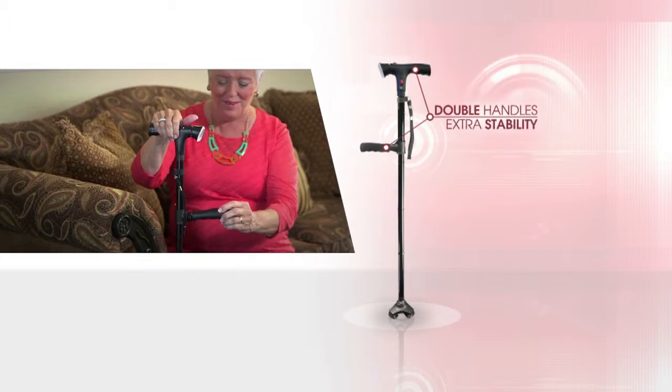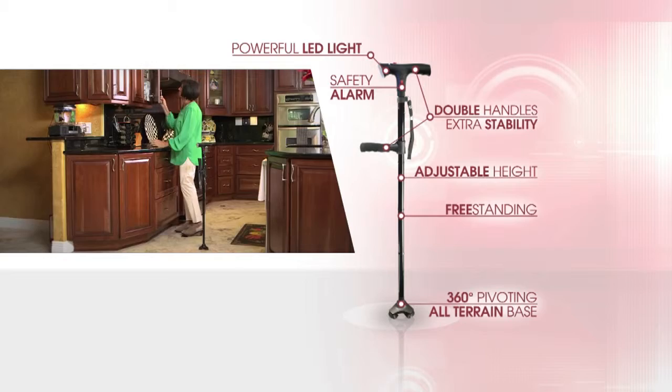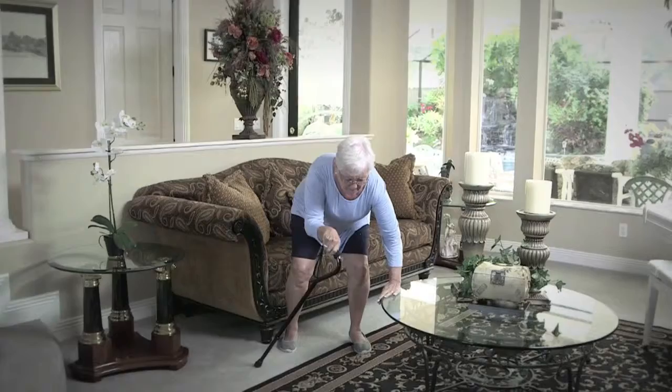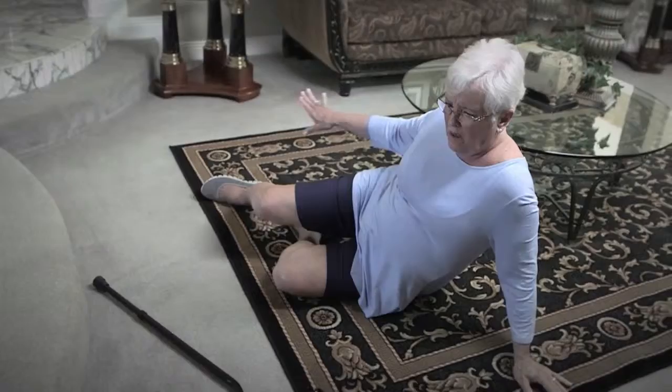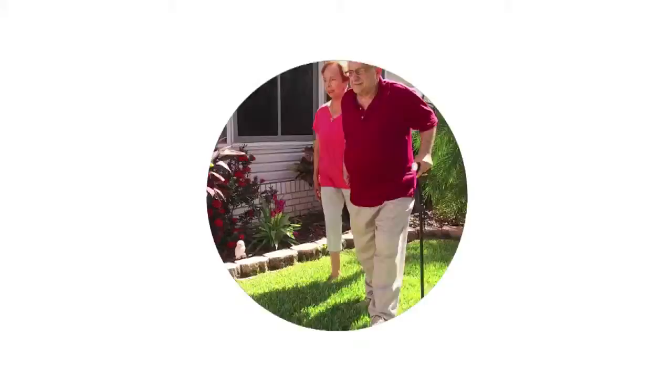The Clever Cane has double handles for extra stability, adjustable height, an all-terrain 360-degree pivoting base, a powerful built-in LED light, a safety alarm, it's freestanding, plus it folds up to go with you. With the old cane, I was always struggling to get up. I lost my confidence and there were a couple times I fell — and that's the worst thing at my age to fall. I mean, you worry about breaking your hip. But the Clever Cane — oh my gosh, I just love it. I just feel so much more stable. I'm getting my confidence back and it's so easy to use. You'll love it. Try it.